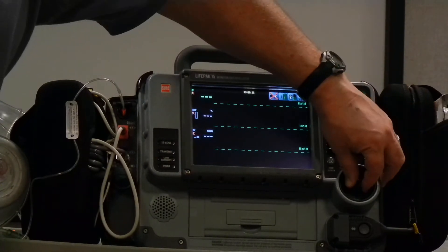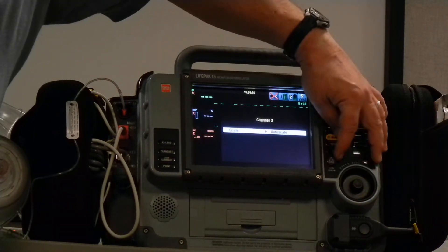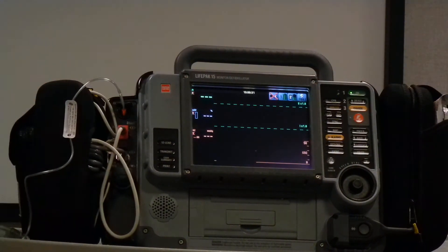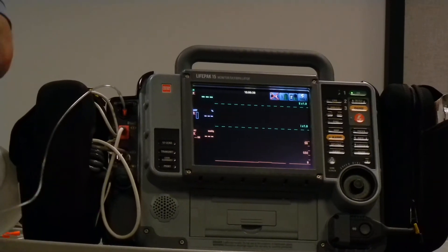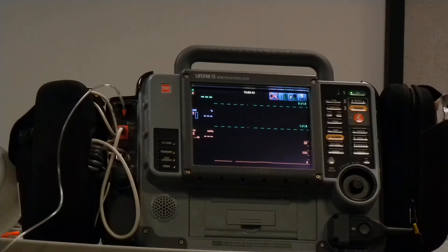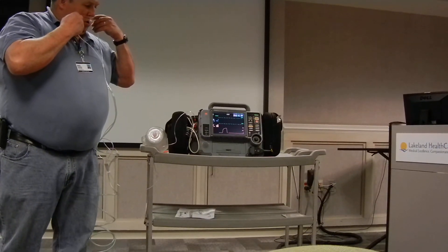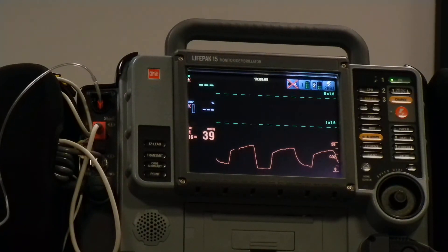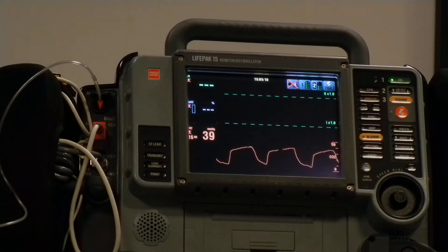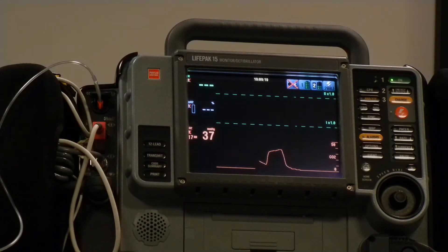You pull up the capnography waveform on your monitor. As you breathe, it will show a wave on the screen. If the ET tube is in the incorrect place and you're bagging but no waveform appears at the bottom of the screen, that means the tube is in the incorrect place and you need to either pull it or reposition. If the ET tube is displaced or wasn't placed correctly initially, you won't have a waveform — no waveform means incorrect ET tube placement.